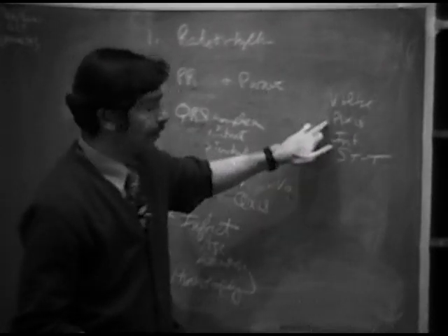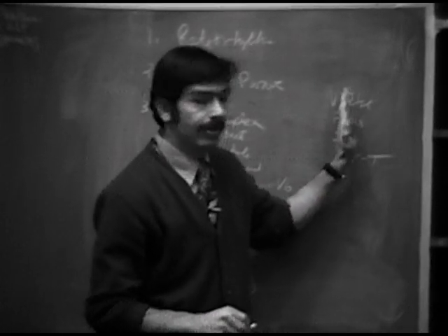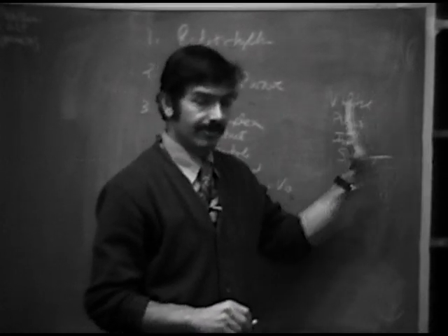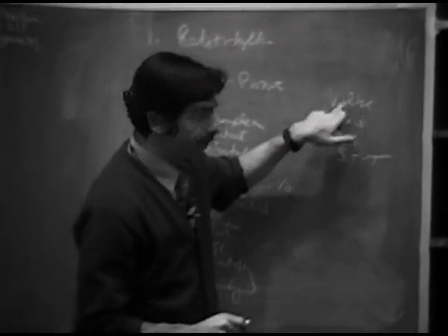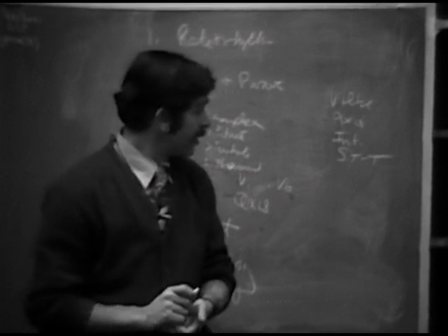And we went over all of these before in great detail, and for the criteria for right and left ventricular hypertrophy, you follow the same outline: voltage, axis, intrinsicoid, ST wave changes.